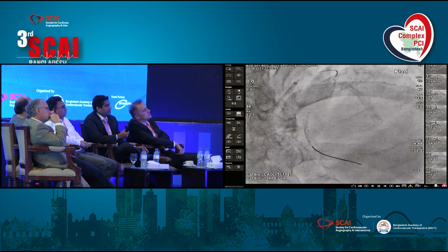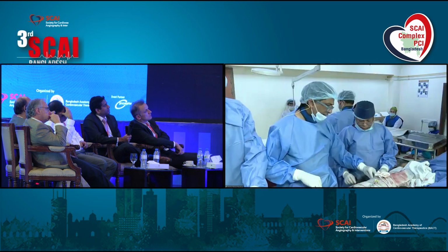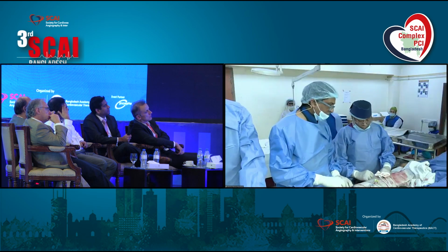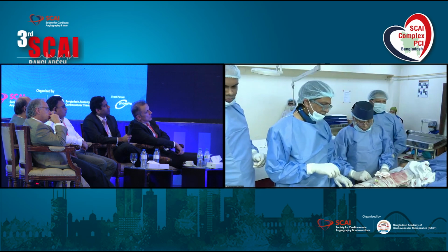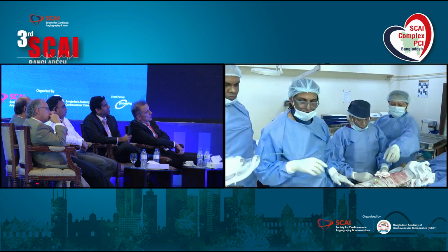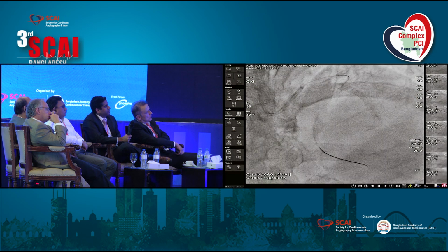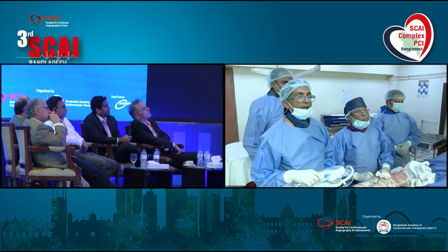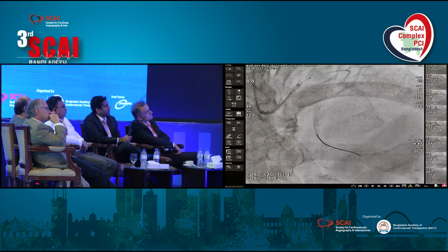So the arc of calcium, you're right, there was an almost 360-degree arc of calcium, and it is a shorter segment, not more than 5 millimeters in length or thickness. That's why we went ahead with direct stenting, and we'll see how IVUS shows now without even post-dilatation. We just post-dilated with the stent balloon, and further decisions can be made even offline. Okay, go ahead and show the IVUS, please.